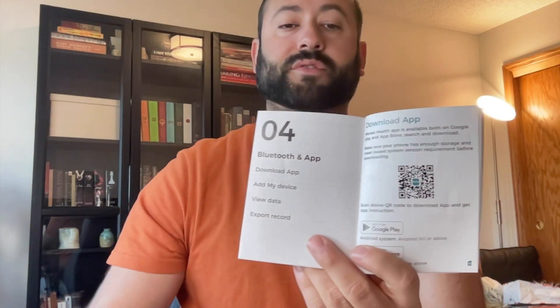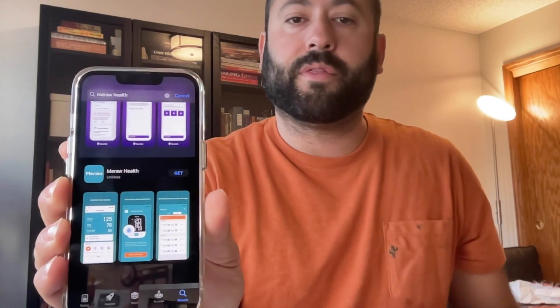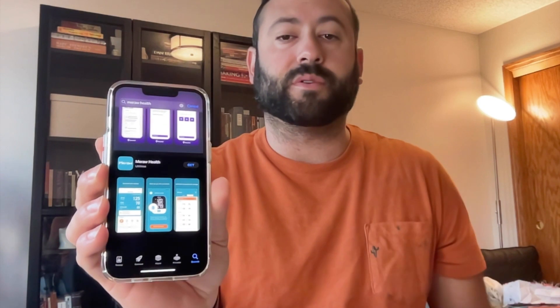Use your cell phone's camera to scan that QR code. I have an iPhone, so I'm going to use the App Store and it will bring you to this page right here. Then click on that Meraw Health icon and it will download the application. It's really easy.